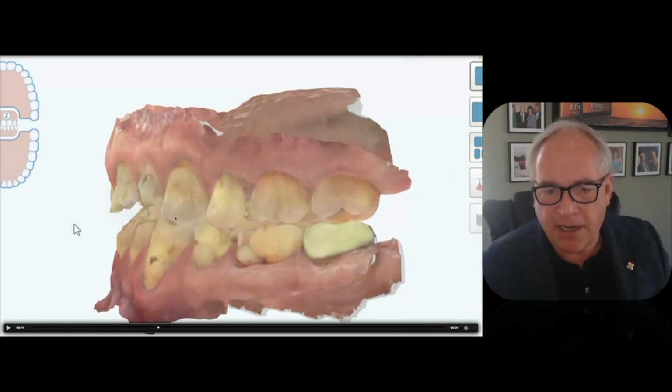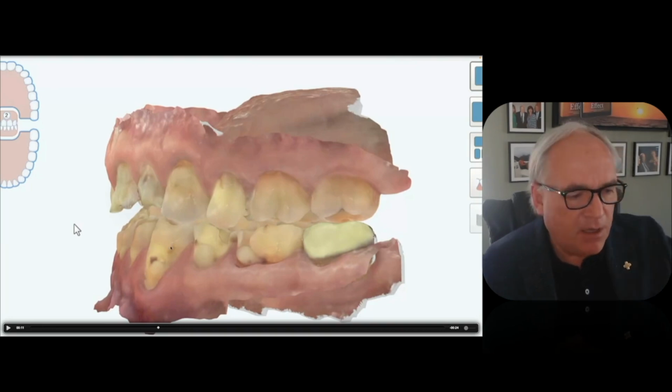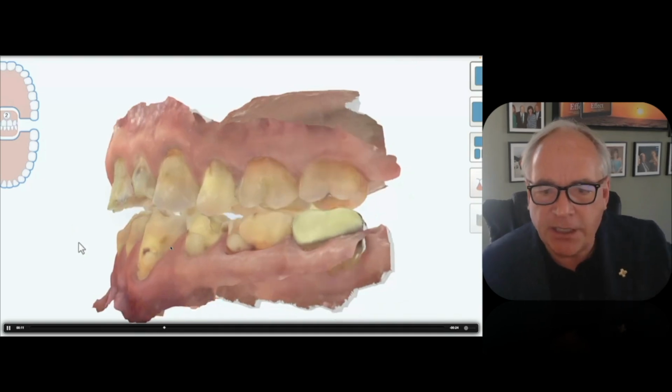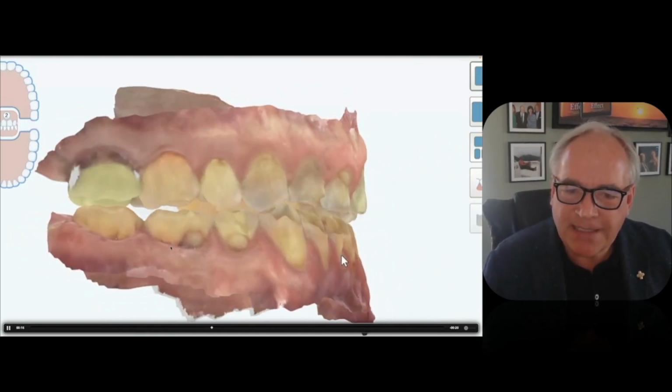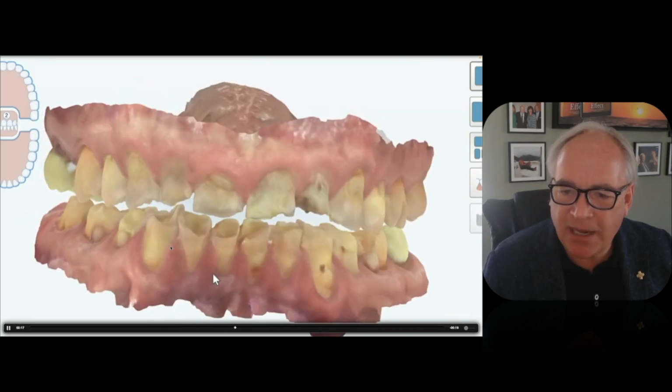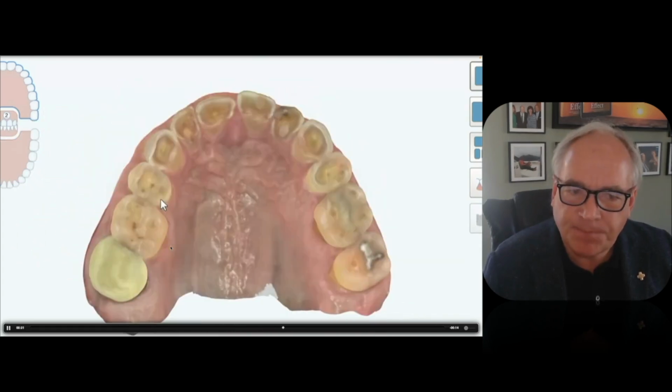And now look at the canine. Remember, jaws don't drop down, they arc open. And so this falls right into a class 1 relationship. And so we can start to imagine how that increased vertical is going to give us space to add back what this guy has destroyed and how we can conserve tooth structure to do that.